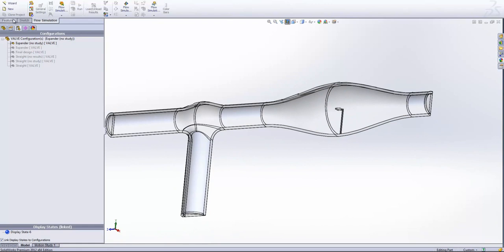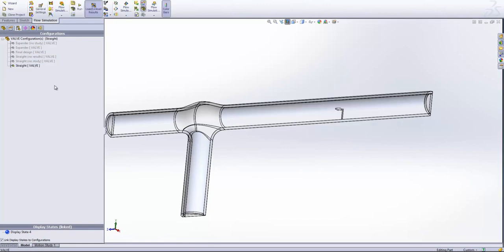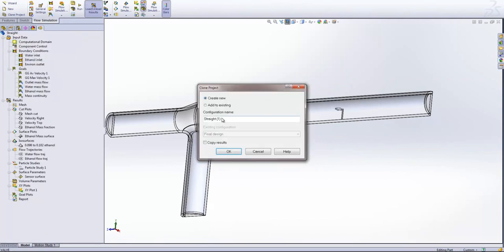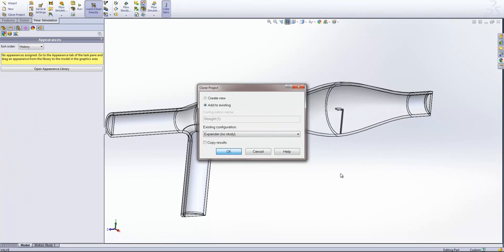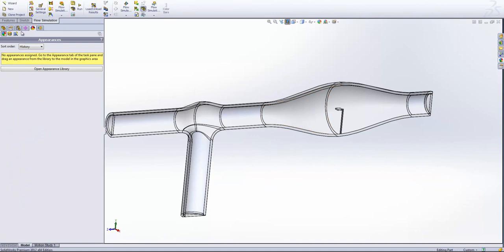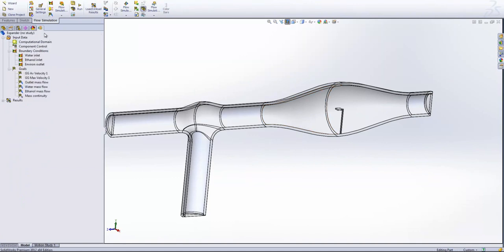Now, to generate the study, we could by all means go back through, use the wizard and try and set up exactly the same settings. But I've already done all that work once, which makes it really easy to do it again. So I'm going to come back to my straight analysis, and I'm going to copy, or clone, the project, and send that setup configuration over to the expander study that hasn't got one already. We'll get a warning that the model is different, so the mesh will need to be changed. So we just agree to that, and now you'll see that we're switched over to the expander study, and we've got the setup exactly as we had it before.